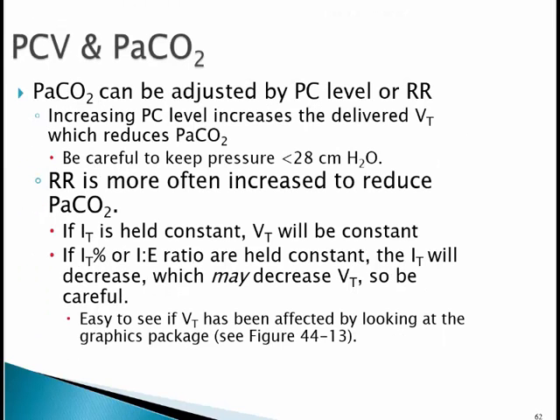In pressure control ventilation, adjusting for CO2. Now, one thing that pressure control offers us that we really haven't discussed yet is it eliminates the issue of dead space, because I don't have to use up my tidal volume now to fill up the dead space. The pressure is what's responsible for inflating the lung, and so if you have a big dead space problem, you probably want to use pressure control ventilation.